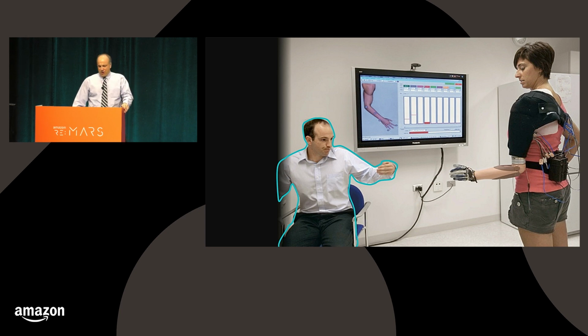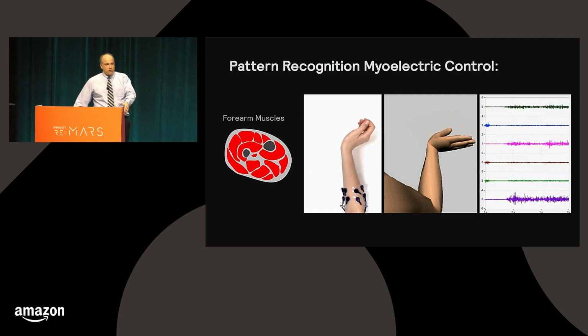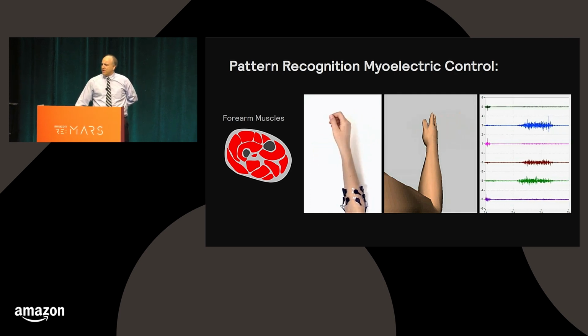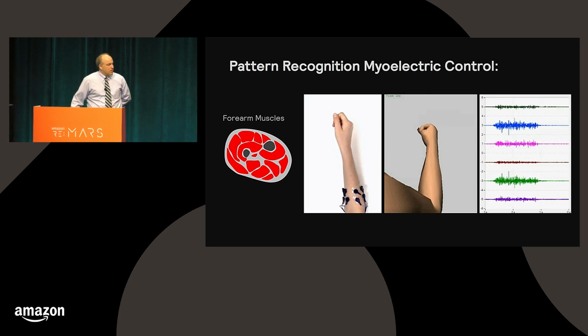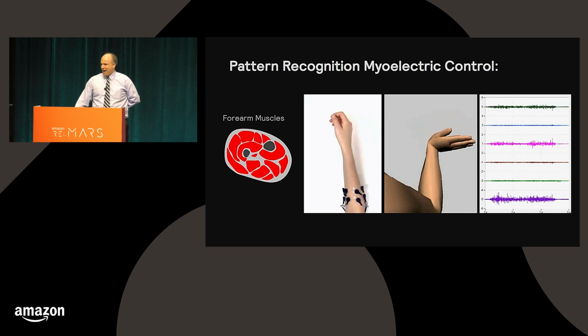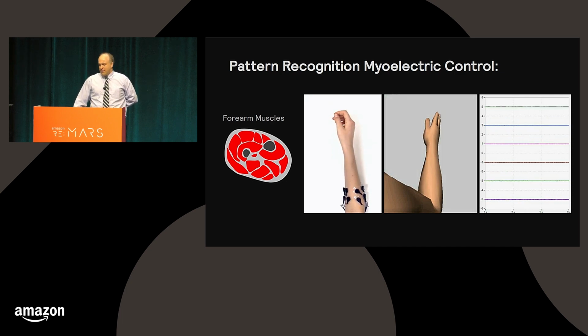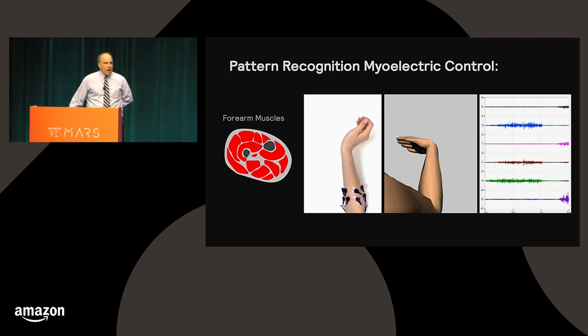And so we've been working in this area, the field has been since the 1940s, and the devices have been used clinically since around the 1970s. The most sophisticated systems in use today use statistical pattern recognition. And the way that they do that is they decode the neural information from your muscle signals. So these signals are called EMG, myoelectric signals. Each time a muscle contracts, it generates a little tiny bit of electricity. It's about 1/1000th of a AA battery. It's very small. But with sensors on the limb, you can detect these signals quite reliably, amplify them, and then send them to an algorithm for decoding.